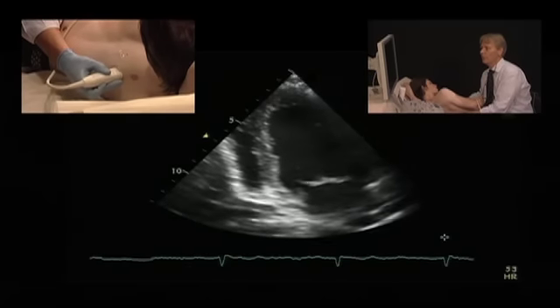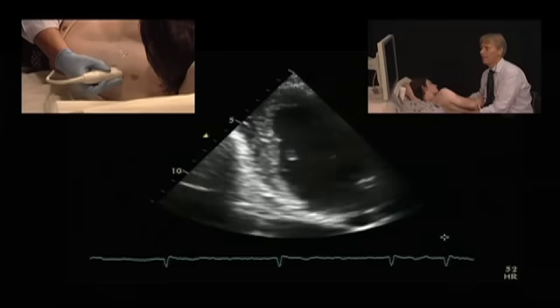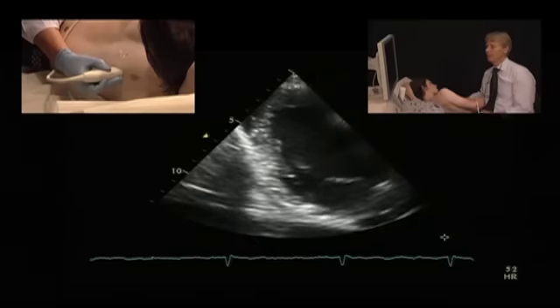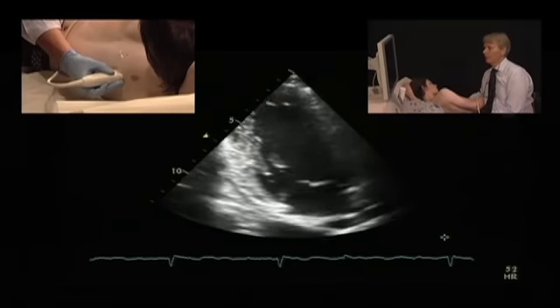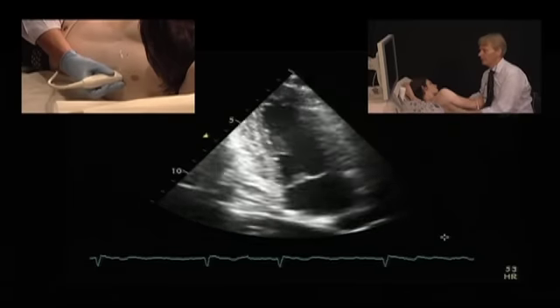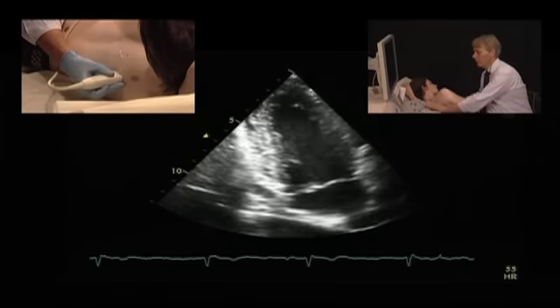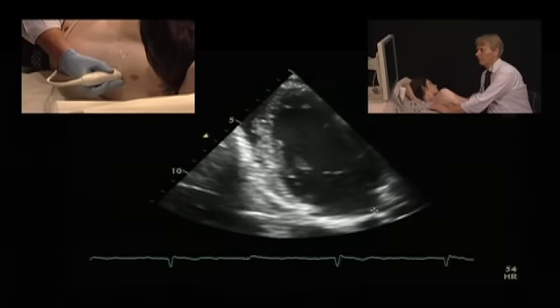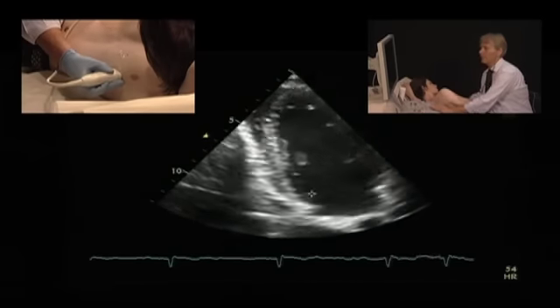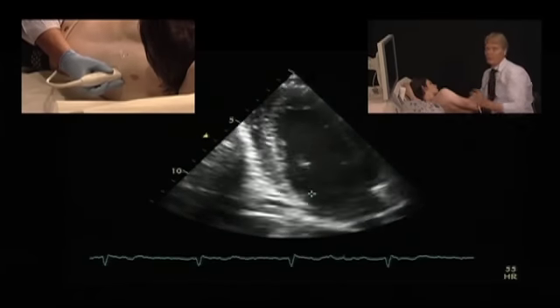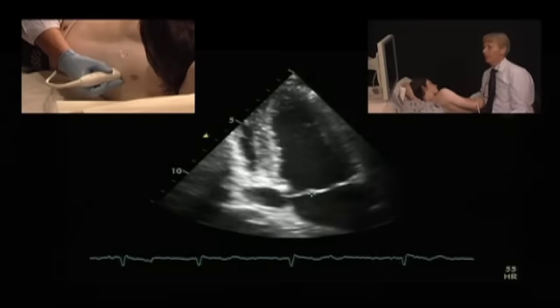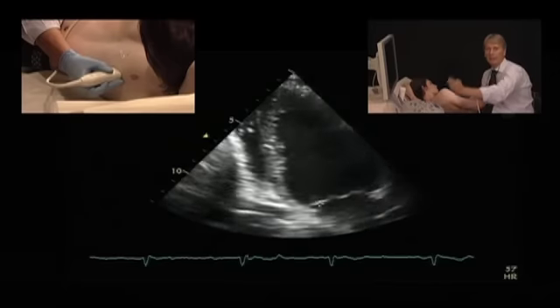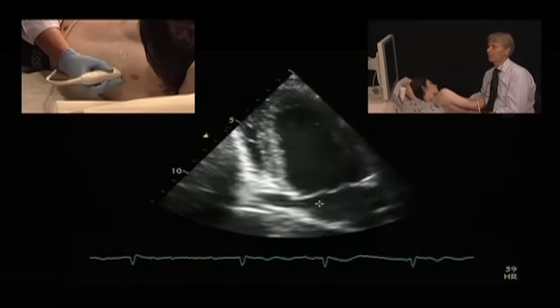You rotate more and more until you finally arrive at the two-chamber view, where you do not see right ventricle structures. In the two-chamber view, what you will be seeing here is the anterior wall, the inferior wall, the left atrium, and the mitral valve, where you cannot distinguish between anterior and posterior leaflets simply because you are now exactly parallel to the commissural closure line.